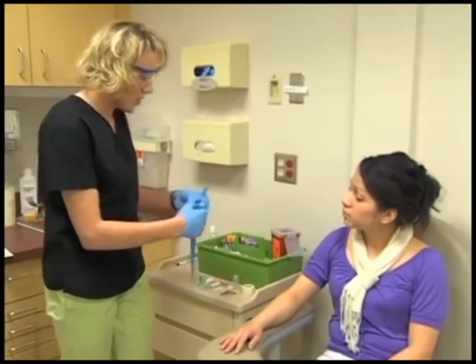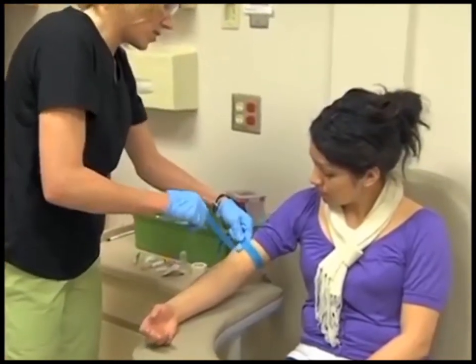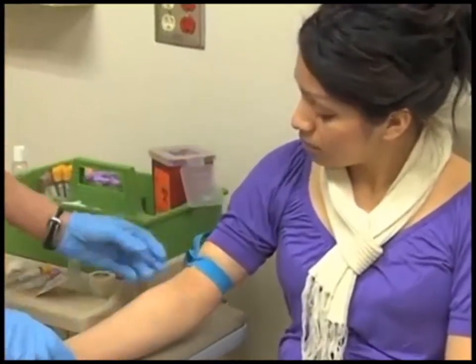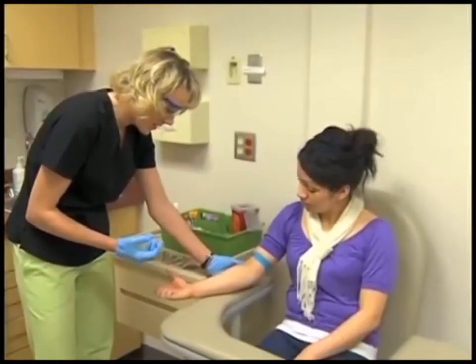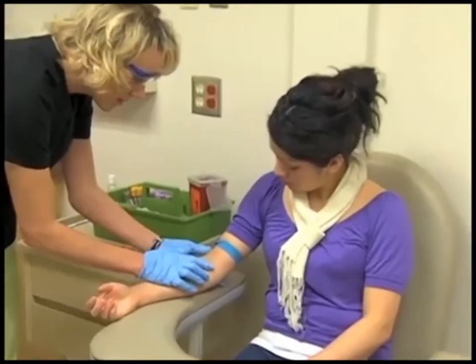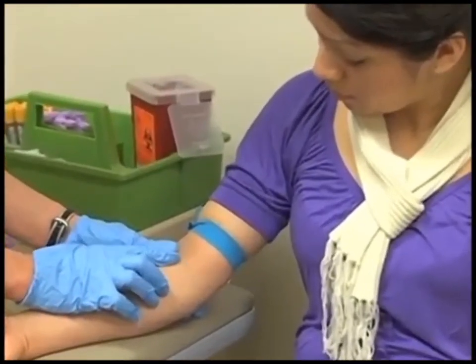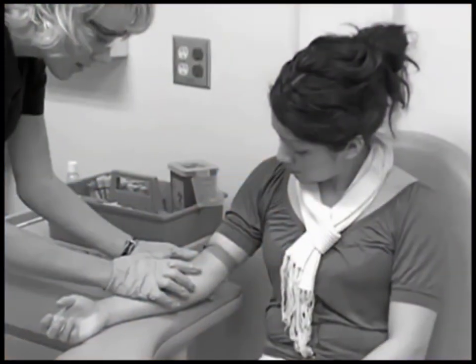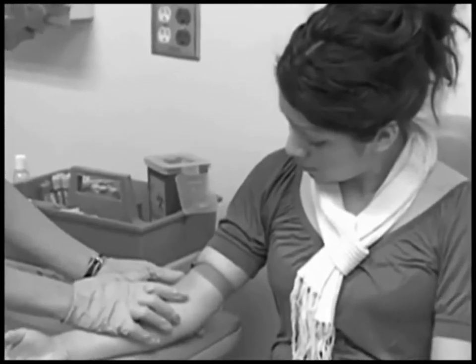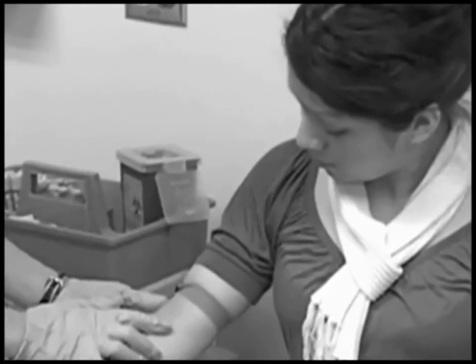An important step in the venipuncture procedure is the application of a tourniquet. The tourniquet makes the patient's veins stand out so they are easier to palpate. It acts as a dam, causing venous blood to slow down and pool in the veins in front of the tourniquet, making veins more prominent and visible. The tourniquet should be applied with enough tension to slow venous flow without affecting arterial flow. A tourniquet that is too tight obstructs both venous and arterial blood flow, which may result in a specimen that produces inaccurate test results. Never leave the tourniquet on an arm for more than one minute at a time.